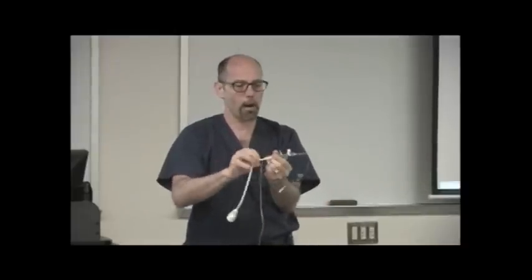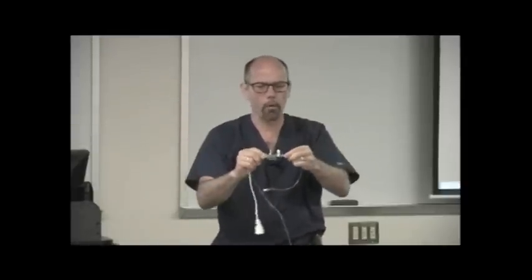So if I was going to put an extension on this because I needed more length, I would need to put similar IV tubing, pressure tubing, on here in order to maintain the integrity of that fluid wave to the transducer. I don't care about behind the transducer. The monitoring is occurring forward. All right? So I'll pass this around, just take a look at what a transducer is.